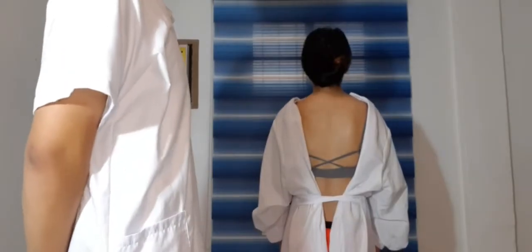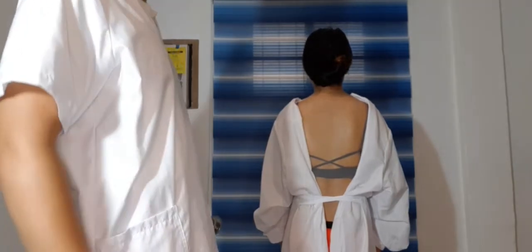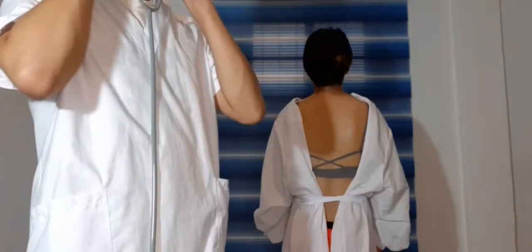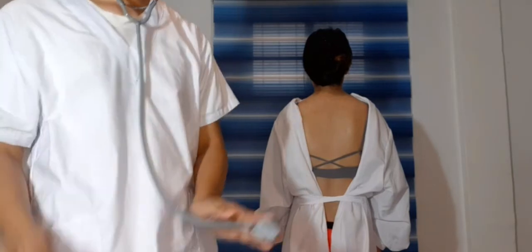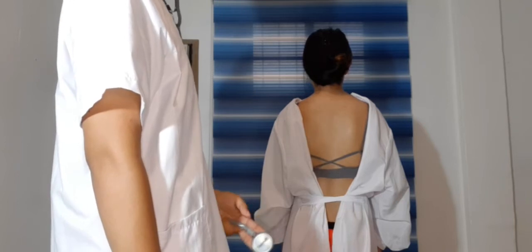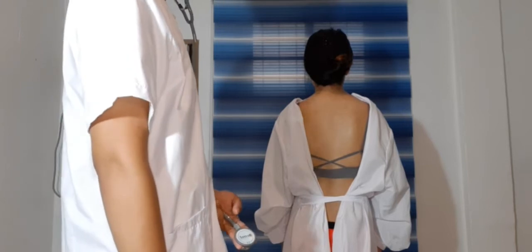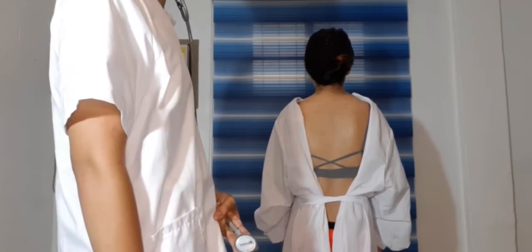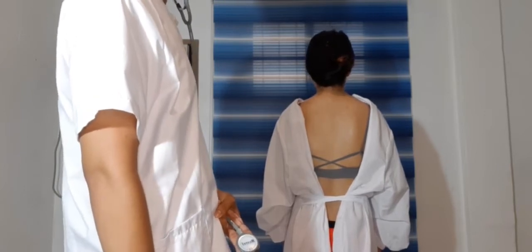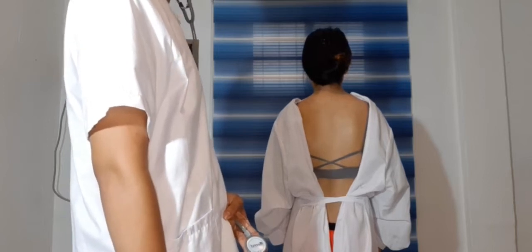And now, we can auscultate the thorax using the flat disc diaphragm of the stethoscope. Get your stethoscope. Now, we're going to use the systematic zigzag procedure. Ask the client to take slow deep breaths through the mouth. Listen at each point to the breath sounds during a complete inspiration and expiration. Compare findings at each point with the corresponding point on the opposite side of the thorax.